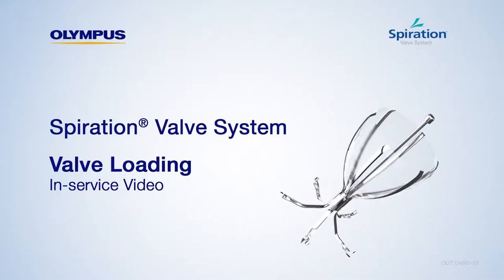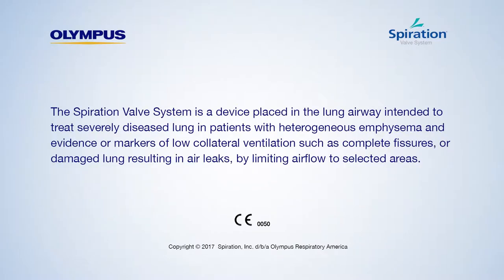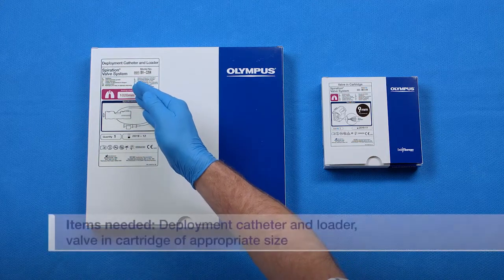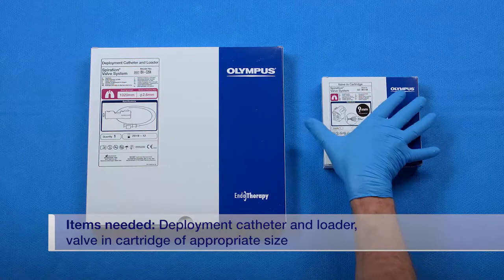Welcome to the Spiration Valve System Valve Loading In-Service. Today we will review the proper steps for loading the Spiration Valve into the C26N catheter. To load the valve, you will need the deployment catheter and loader, as well as the valve-in cartridge of the appropriate size.